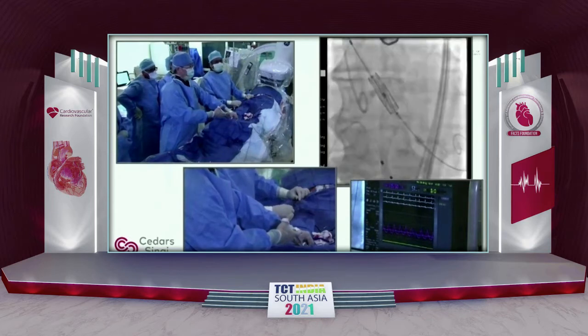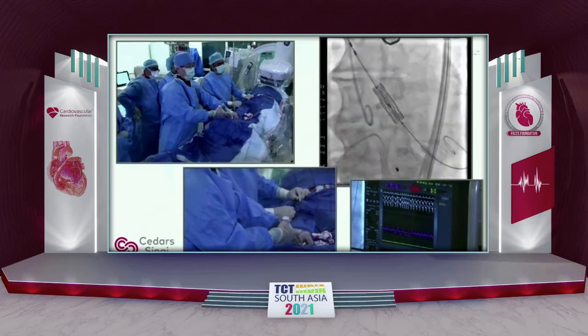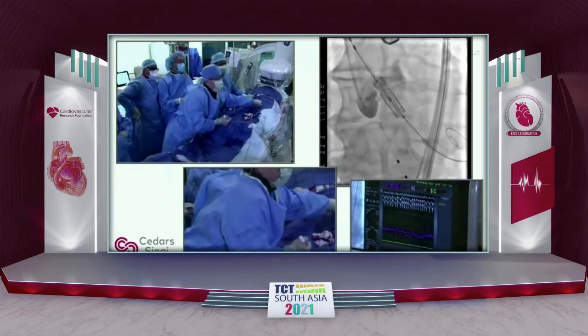So let's just go ahead and try again. Ready at 180? Okay, all right. So it's still not capturing every beat. So that's why, let's see if it... Now it's okay. Sometimes, yeah, there you go. Okay, go up.